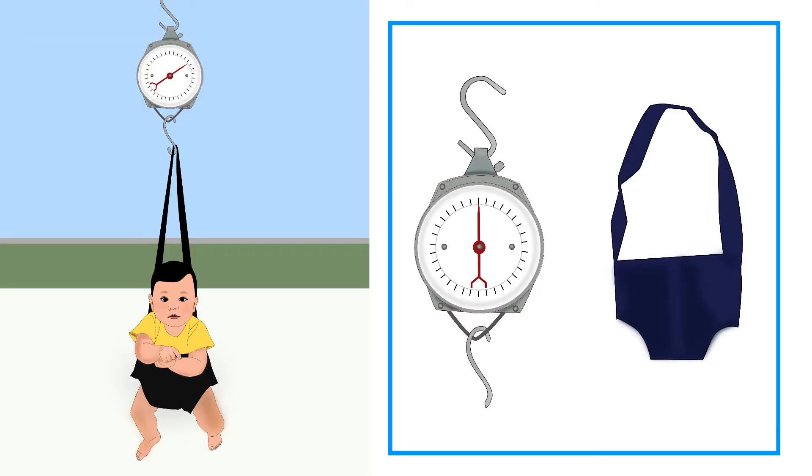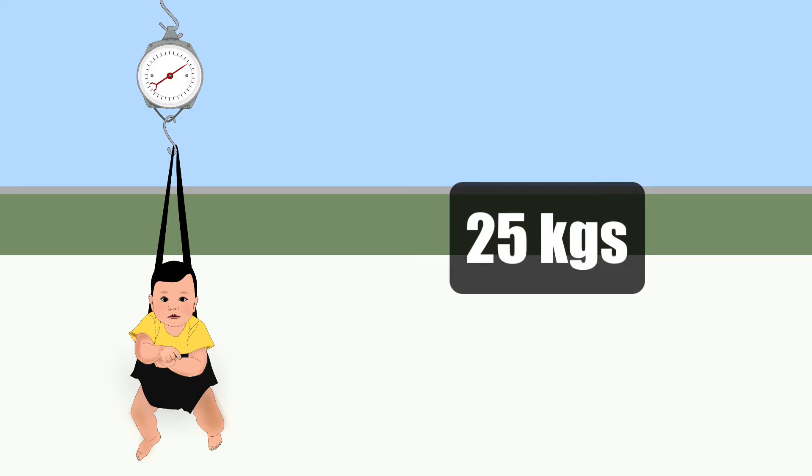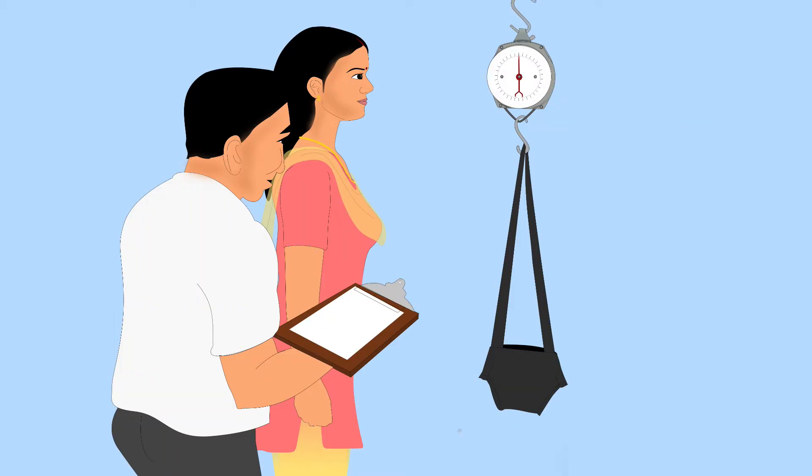Let us learn how to measure weight using a Salter scale. The Salter scale is a spring-hanging scale. It can weigh up to 25 kg. To measure weight, you will need weighing pants or a bucket. In this tutorial, we will be using weighing pants. Before weighing the baby, attach the pants to the scale.